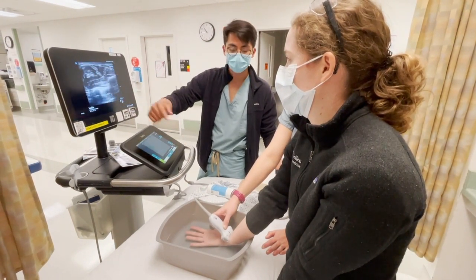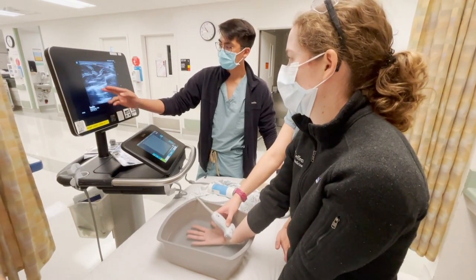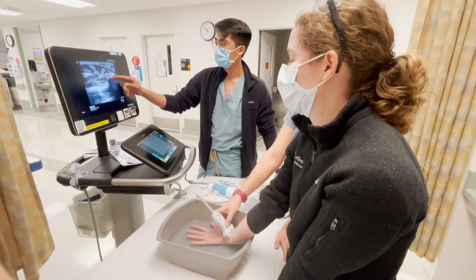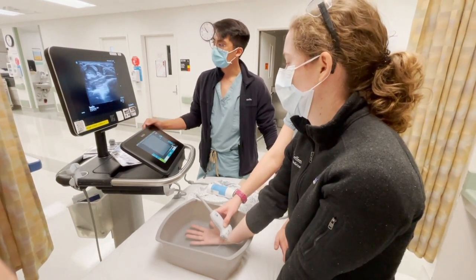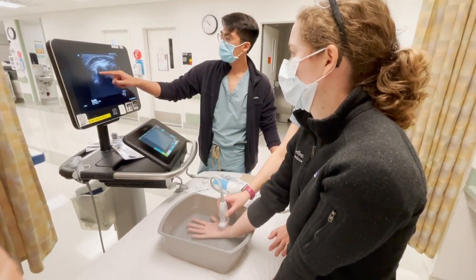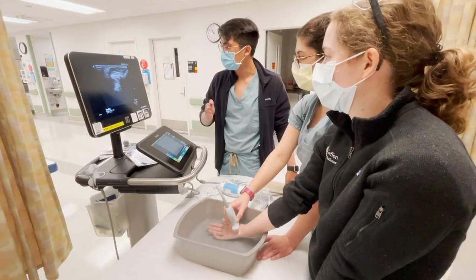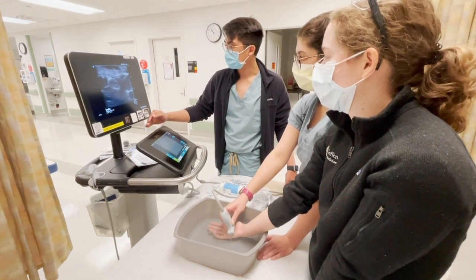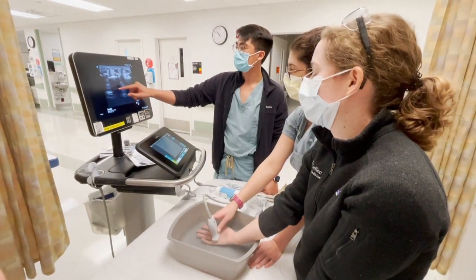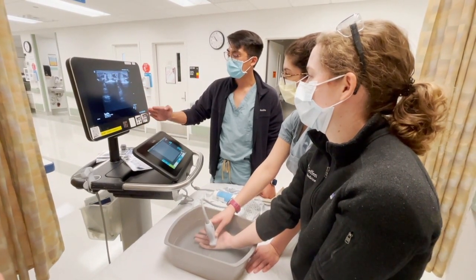The indicator is on the medial side of the patient, on the left side of the screen, which corresponds to the ulna bone, with the radial bone on the other side. As we slide inferiorly, we'll start to see some of the carpal hand bones — there's more echogenicity here; this is actually the scaphoid bone. As we move more distally, we'll start to see the metacarpals come into place.